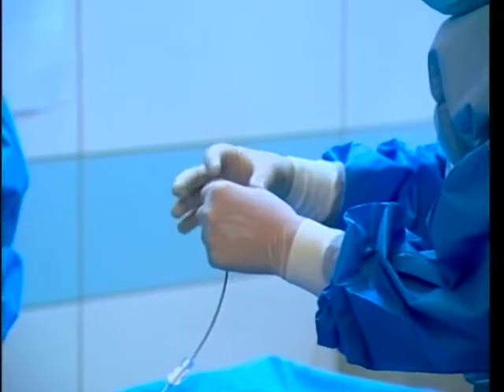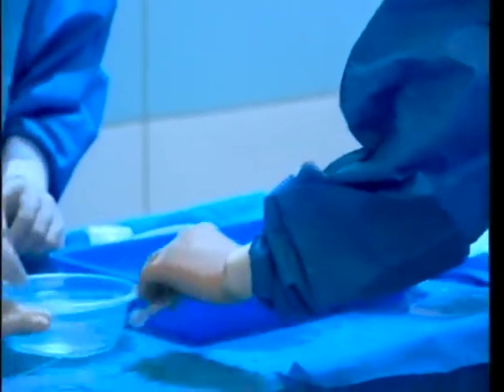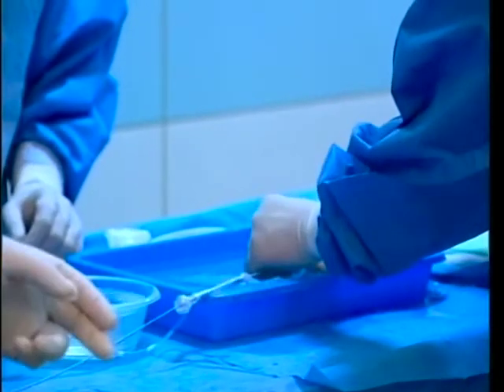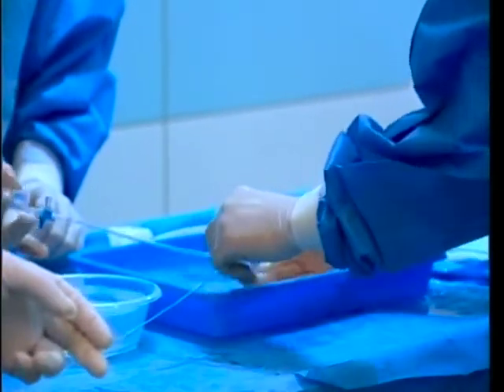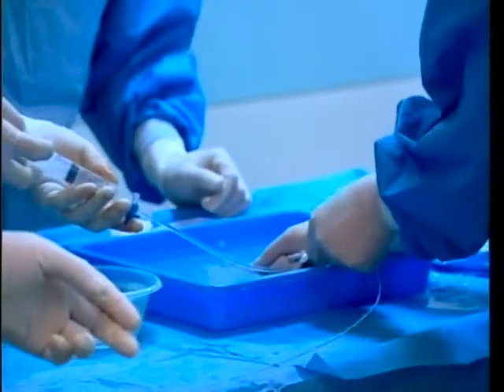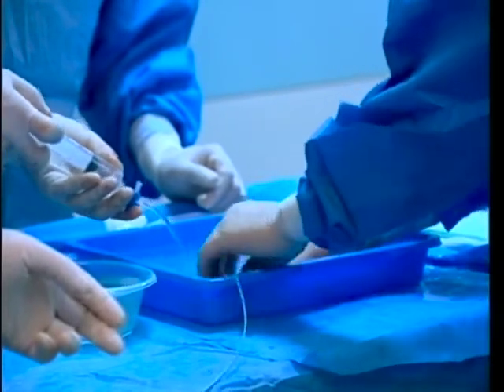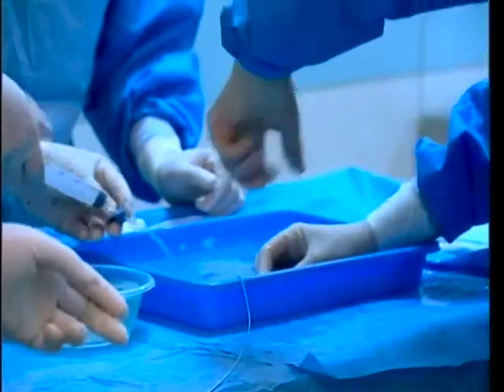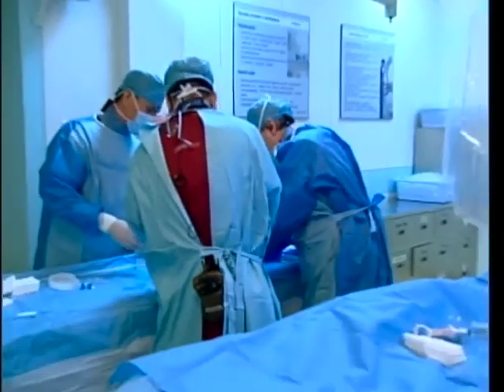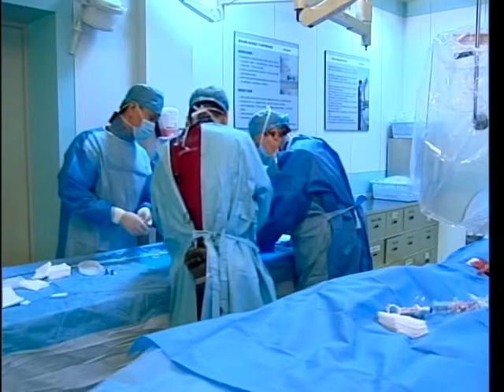That's also the time we would do cardioversion if a patient shows up with atrial fibrillation, and we are not concerned then about thrombus formation, right? I completely agree that it's reasonable, and at the same time once in a while we do see thrombi form in that short period, and that's one of the advantages of having either TEE or intracardiac echo during the deployment procedure. That's why we do it during the procedure, but this probably depends upon the logistics in the different cath labs. Sometimes it is difficult to get the echo people in.